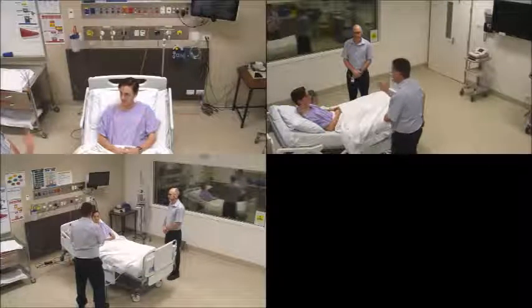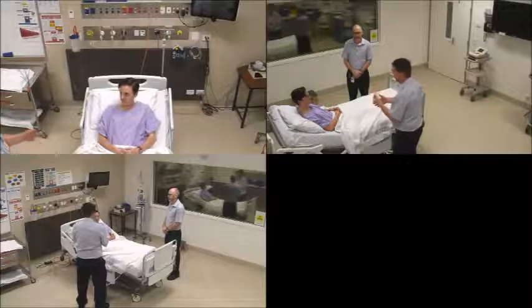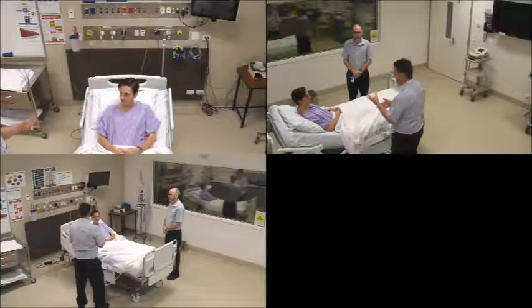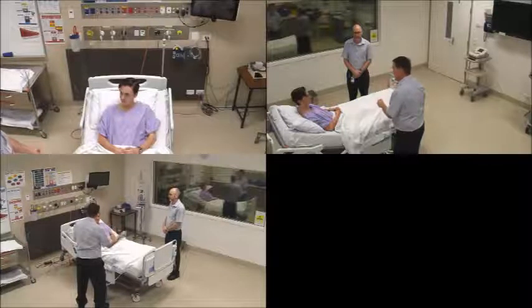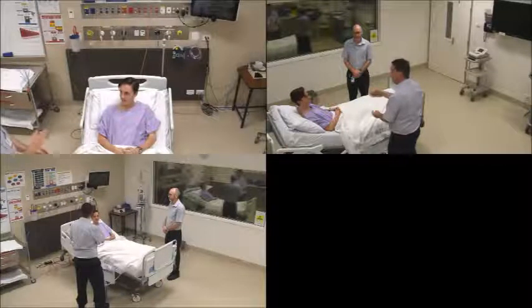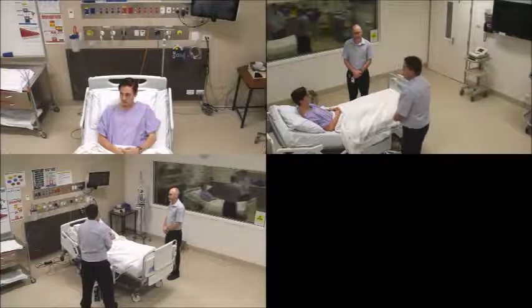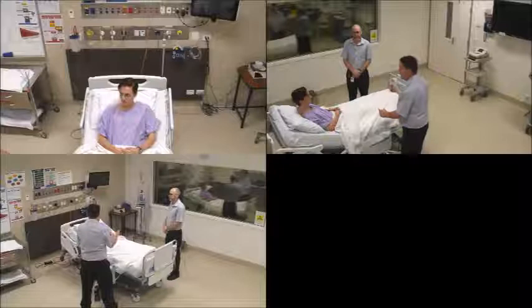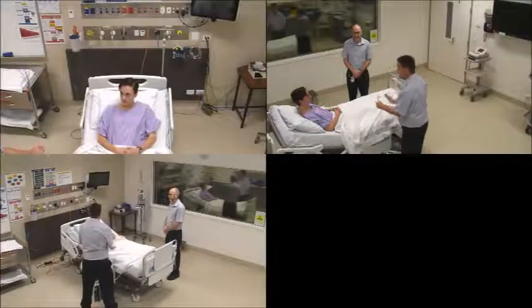The breathing technique that we use is one where we'll ask you to take a deep breath in, breathe out, breathe in, breathe out. Take a deep breath in and hold it, and that's when we'll take the tube out. We'll practice that a little bit closer to the time. We always take tubes out in pairs, so when I take the tube out, I'll be pinching your skin, and Kim, my assistant, will put a steri-strip in the dressing over the top.